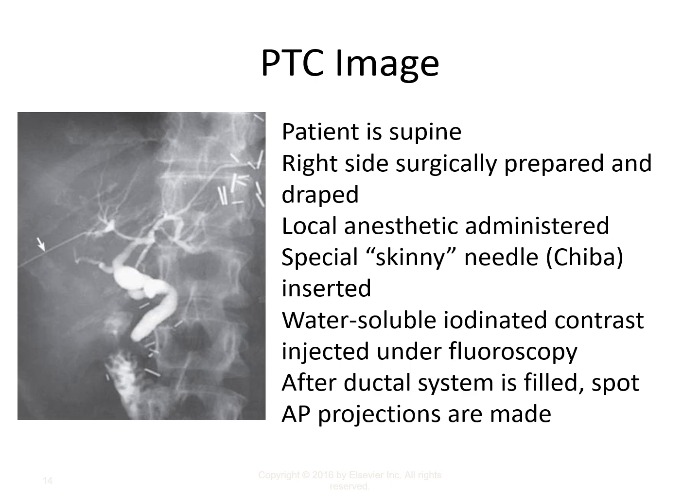So lots of staples present. Looks like the patient has had some surgery as well. It might be that they've had their gallbladder removed because I don't see a gallbladder filling specifically. It looks like there might be a cystic duct here in the middle of the image, but it looks like it comes to an end in close proximity to the staple.